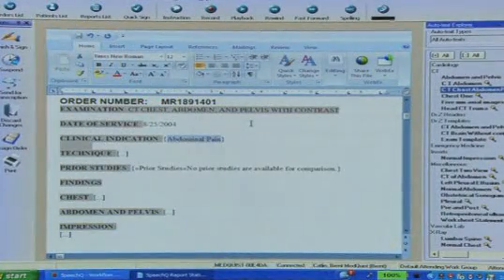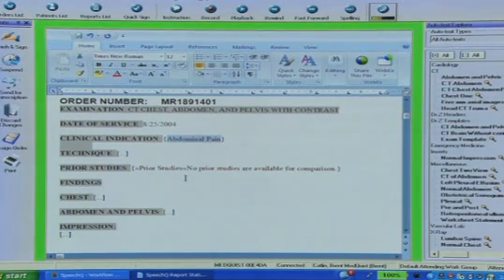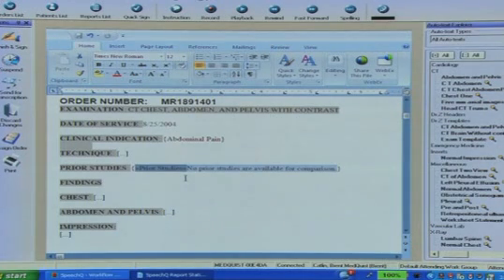We build structured reports utilizing 3 different technologies. We have fields, smart fields, which are those areas we can bring in from the demographic data in the RIS, and also, of course, named fields, which are fields we can immediately navigate to by giving a voice command such as go to prior studies. It selects that and allows me to make a change to that individual location.